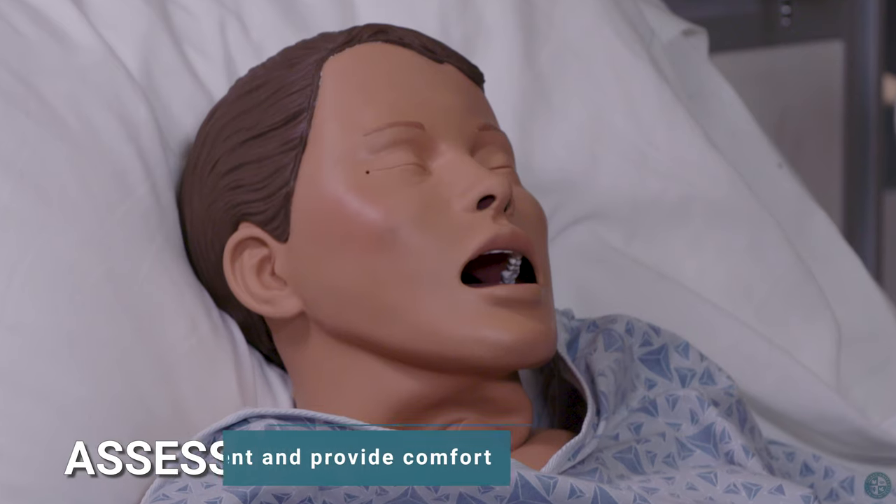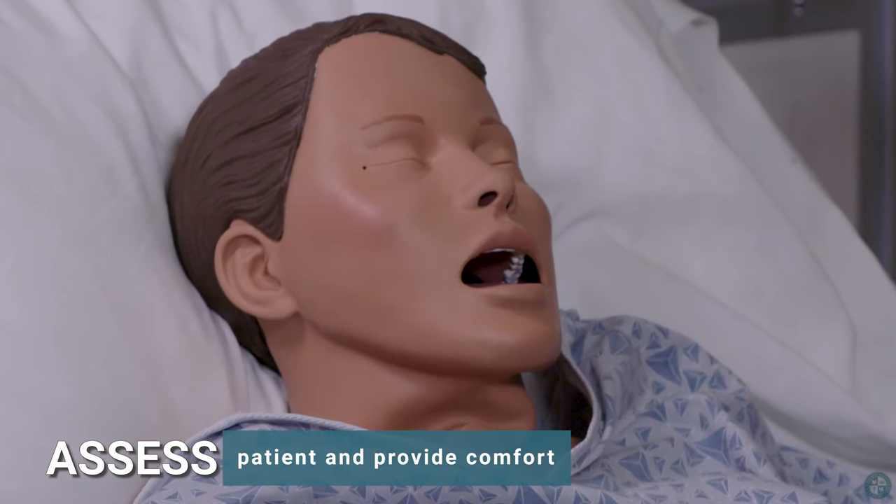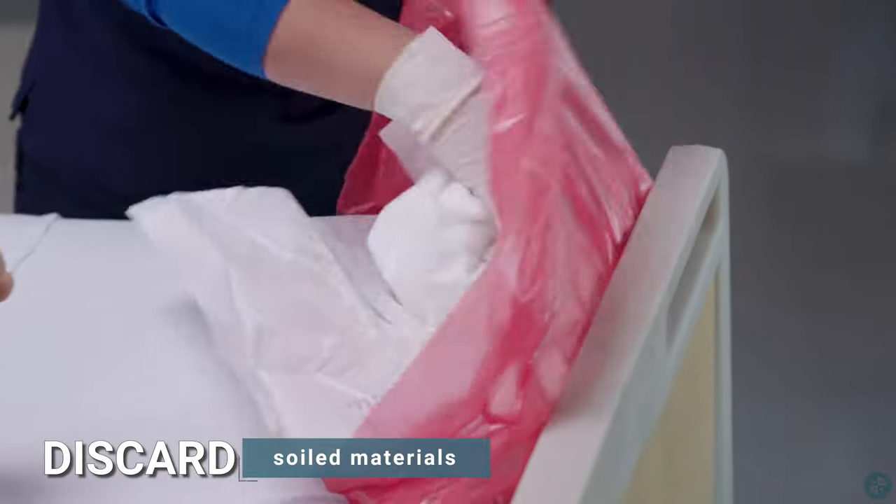Assess patient and provide comfort. Discard soiled materials.